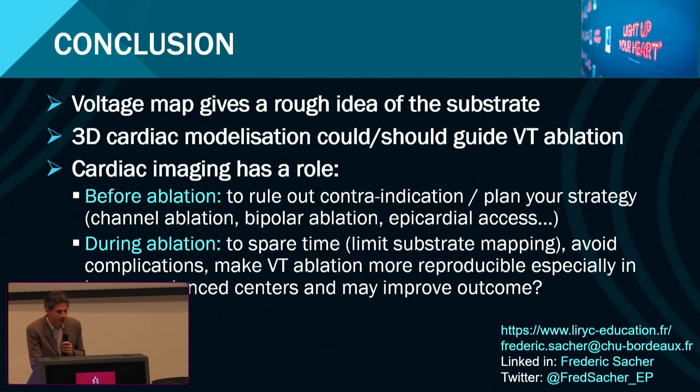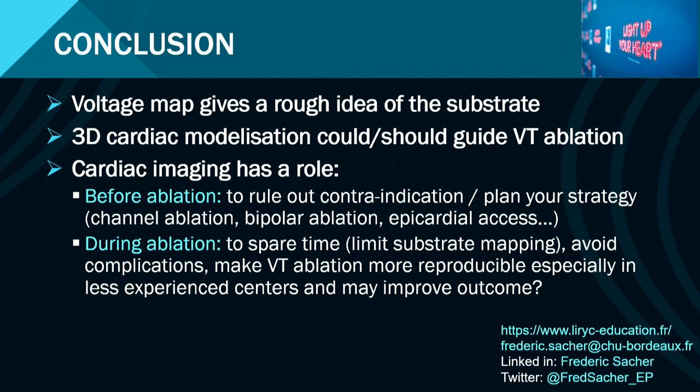So in conclusion, ladies and gentlemen, voltage map is important, but it gives you a rough idea of the substrate and requires quite some experience for VT ablation. It takes time, whereas the 3D cardiac modelization could or should, at least could, guide VT ablation. We think should, but at least could so far. So before ablation, imaging is important, and this was the talk of Hubert Cochet yesterday.